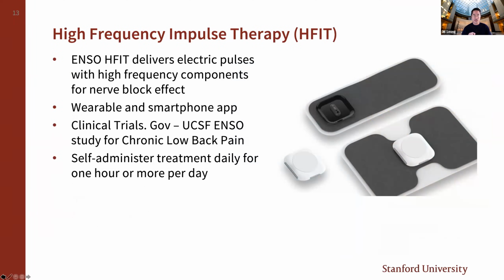But there are devices that you can get and that should be available pretty soon. One of these that's being studied locally right now, just up from Stanford at University of California, San Francisco, is this HFIT, or high frequency impulse therapy. And this one's interesting because it uses high frequency components in order to block back pain. And that's really what they're studying it for.